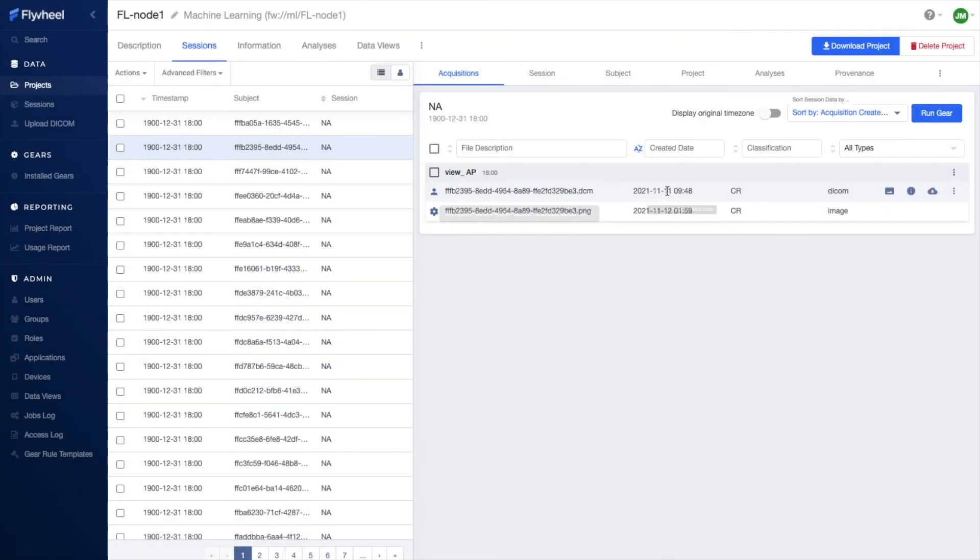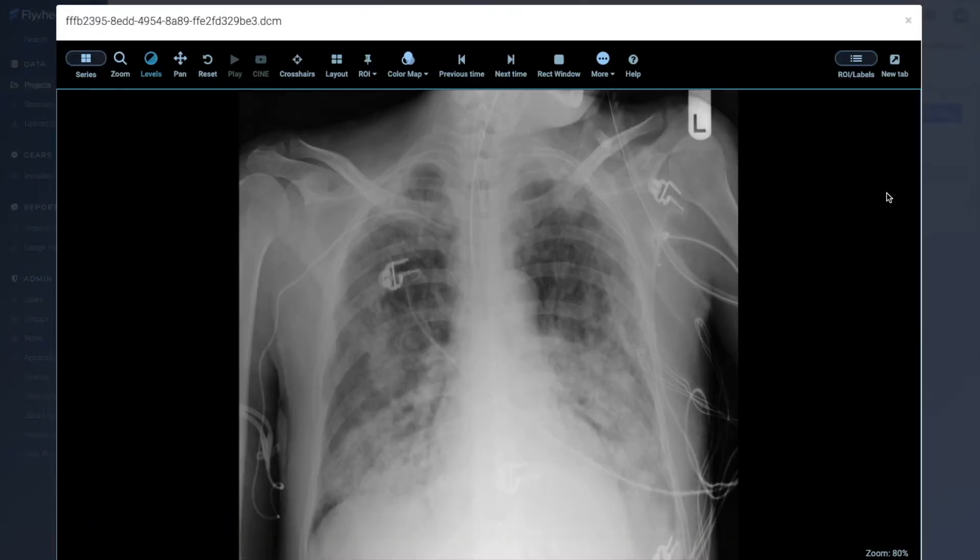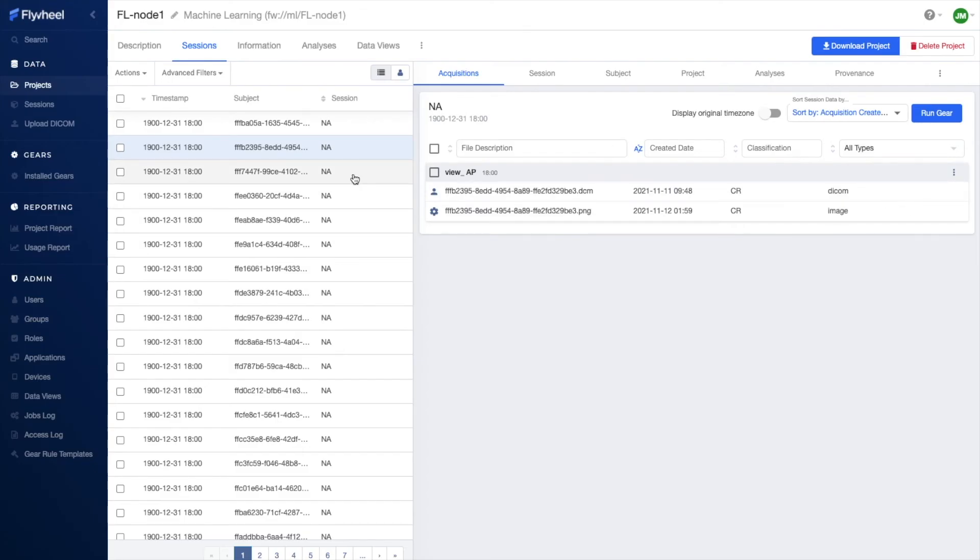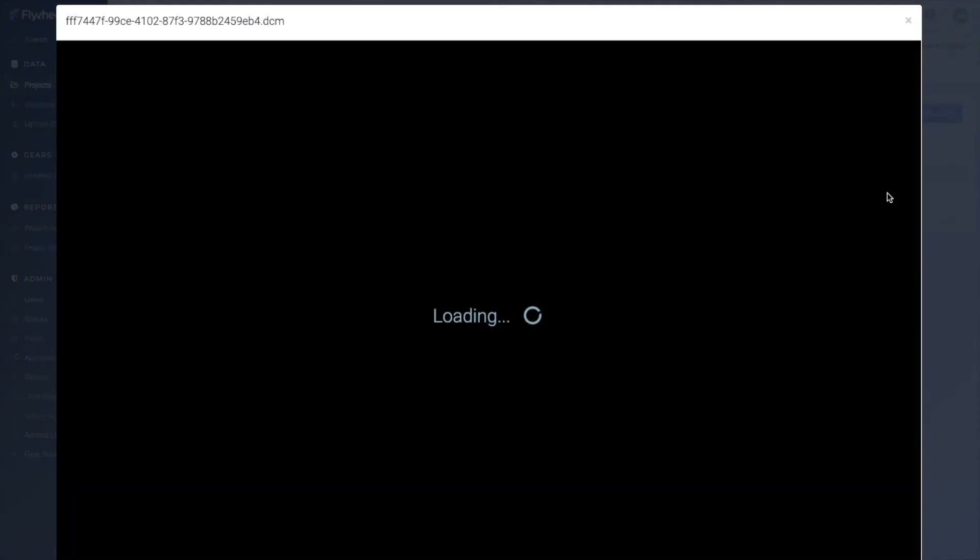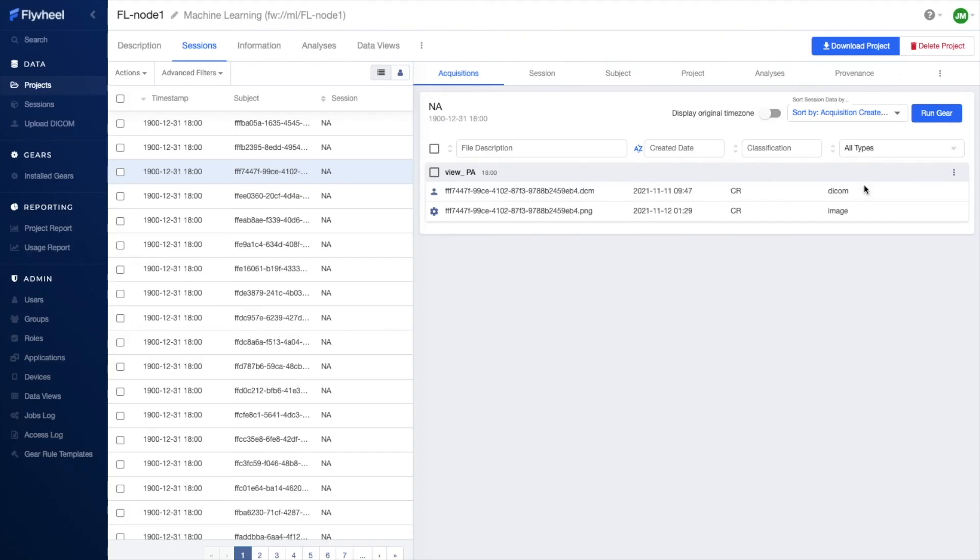This end-to-end solution is powerful in that it leverages Flywheel's data management and curation tools to ensure the data was efficiently prepared for federated machine learning. Specifically, each Flywheel site was used to ingest a large volume of chest x-ray data, where Flywheel's compute platform automated the preprocessing of these images.